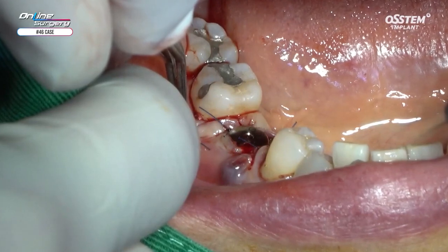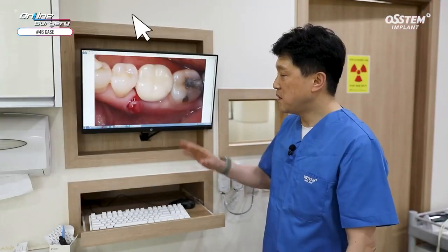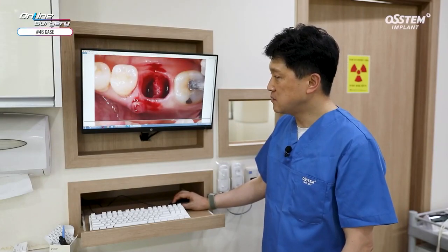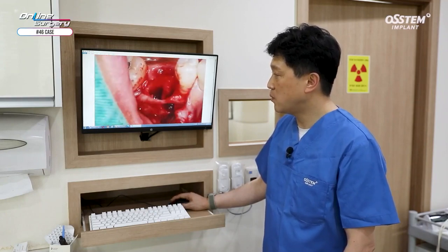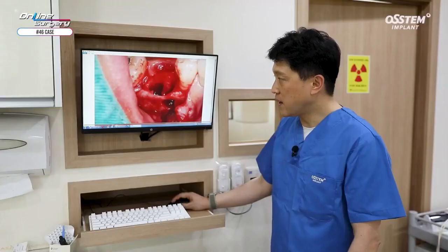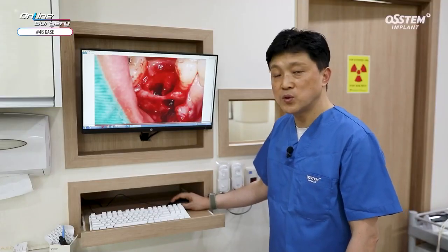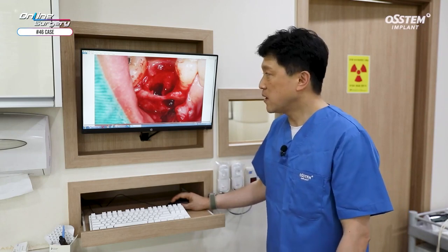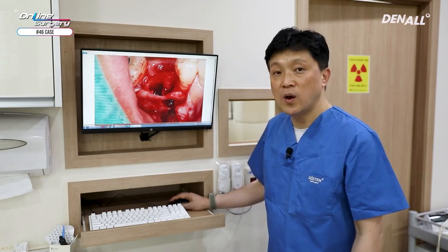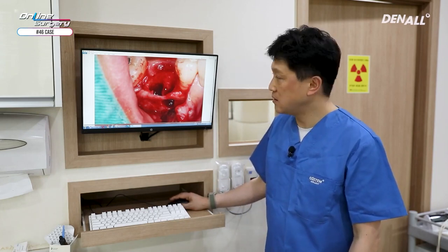That was the surgical clip. Let's review the case. You can see that on the mesial side, following the fistula tract, you can see fenestration defect. As shown, you can see there's perforation and bone loss. At the very top of furcation, you give indentation using lance drill and use it as drilling guide, but it's very difficult to do this here.